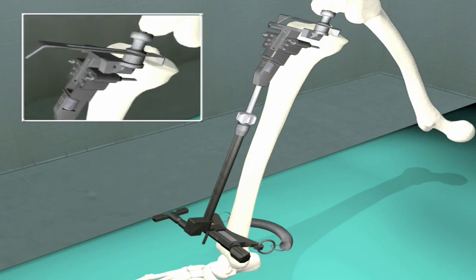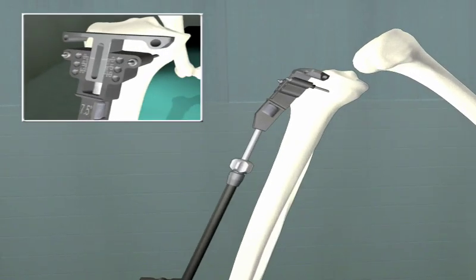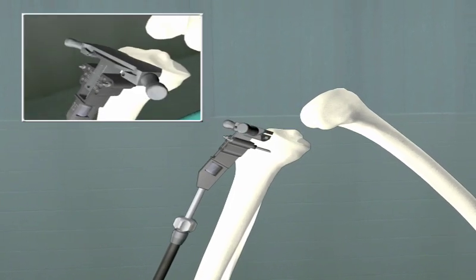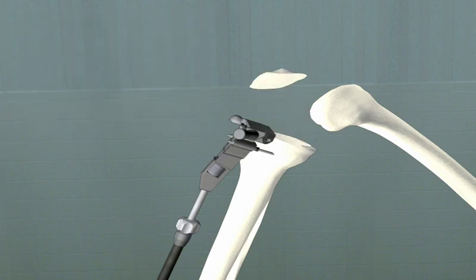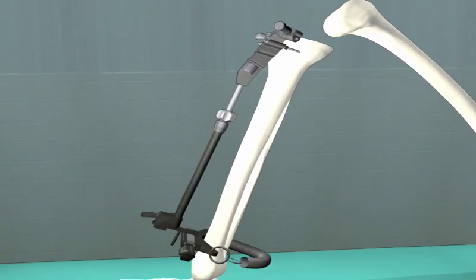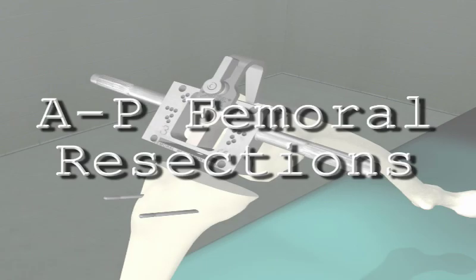The dimensional caliper is removed, and the adjustment block can be moved upwards or downwards depending on the amount of bone resection required. Note that the inclination angle is anatomically inclined posteriorly to approximate the patient's own posterior inclination angle. Once this has been performed, the guide can be removed, and the femoral resection guide is then positioned into place.